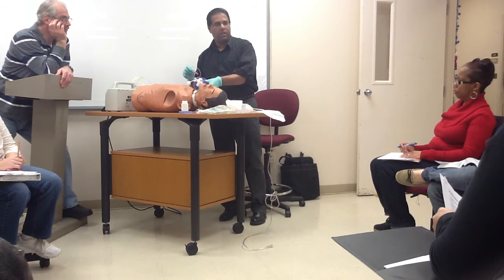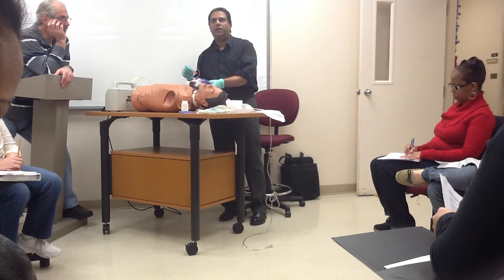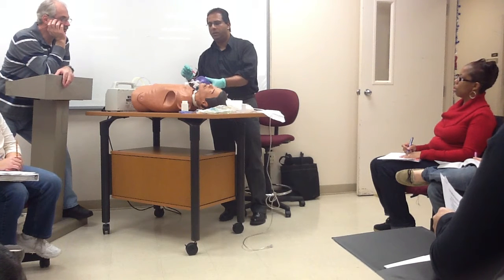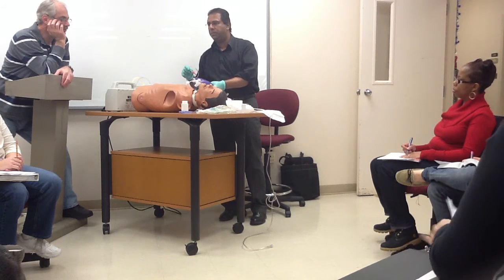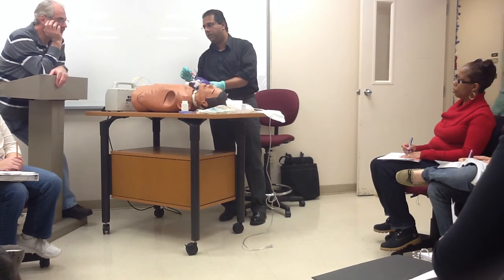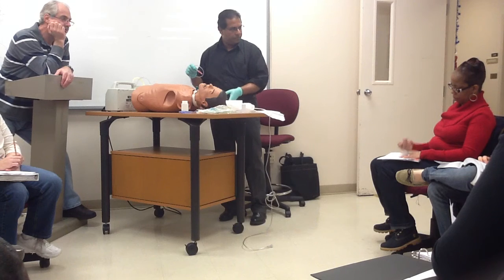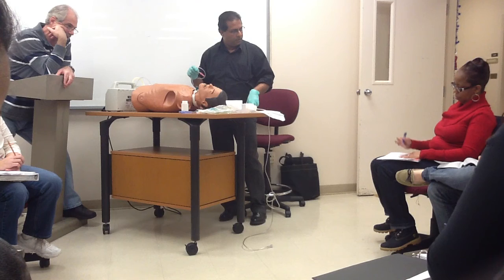Okay, you ventilate them. At this time, you're looking at the monitor. What happens if they go into some kind of tachycardia, like a heart rate of 190? You hyperoxygenate them, continue to hyperoxygenate them until they get better, or you call somebody, or tell the nurse, or call Code Blue, or whatever you have to do. When you suction the first time, then you put some more oxygen.